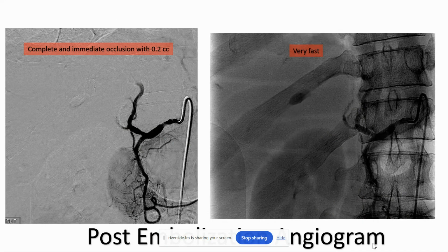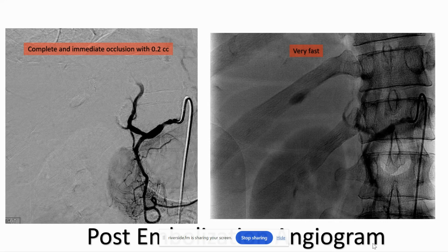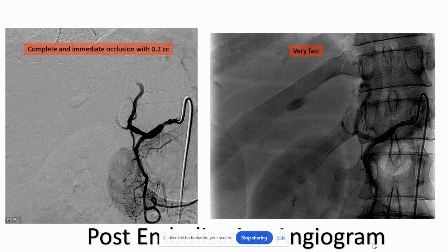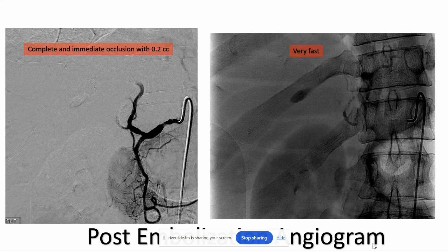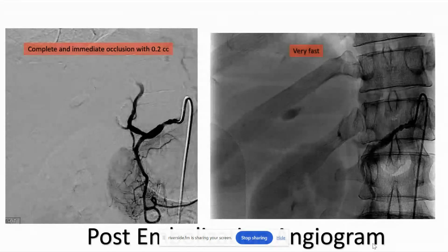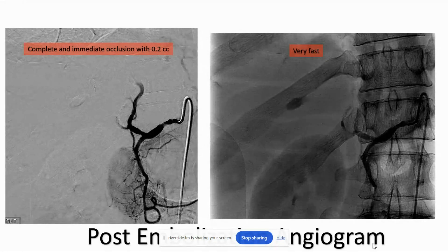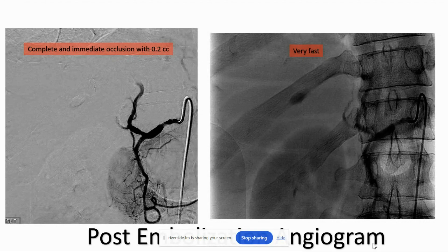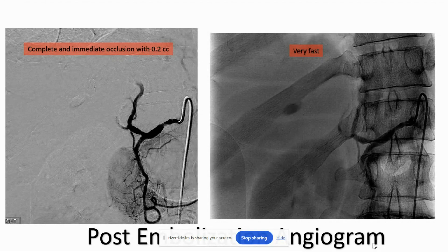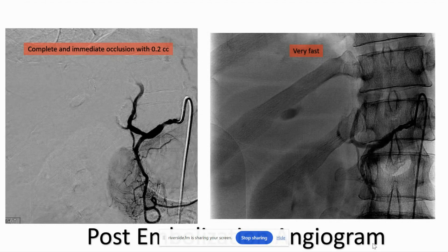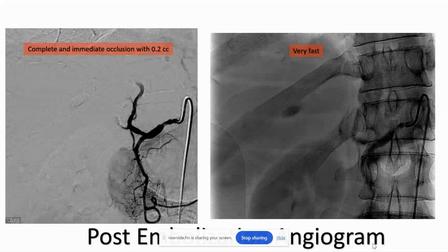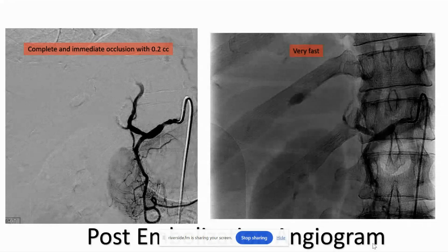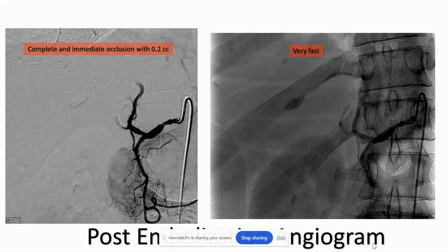After just 0.2 cc's, you get a complete occlusion. It's completely static. There's no flow through it. And you can see on the dynamic image on the right, there's no flow going into that vessel. Really tiny amounts. It's really fast. That whole fluoro loop I just showed you was the actual procedure itself — that was really all of it.